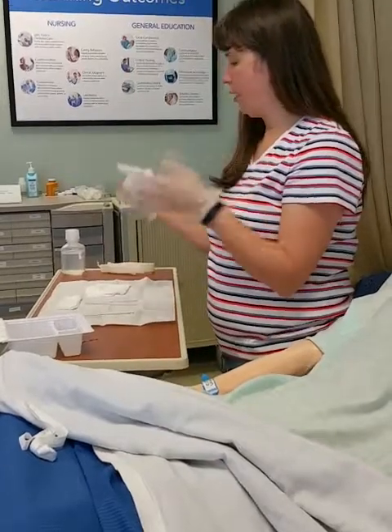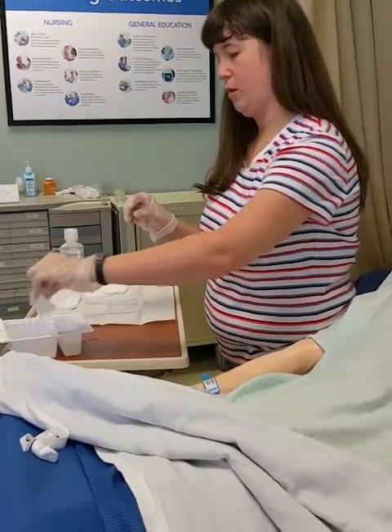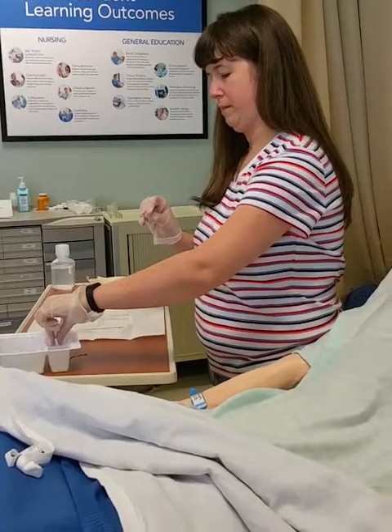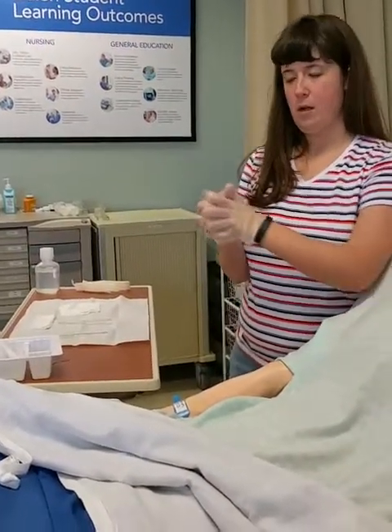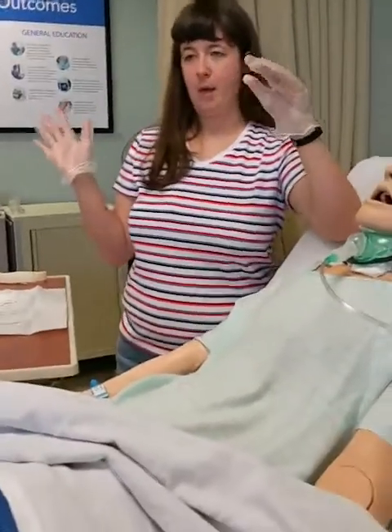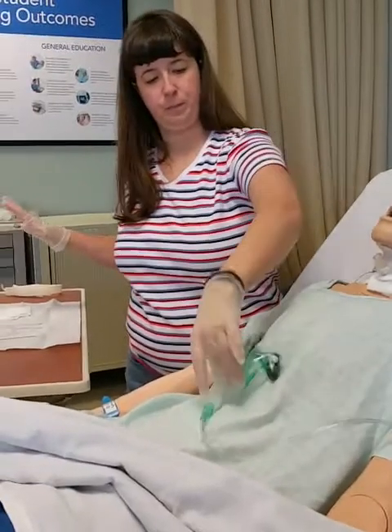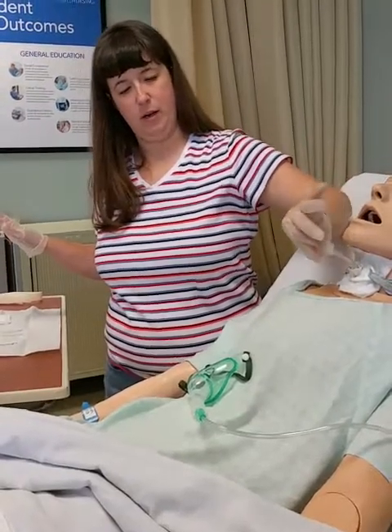And I want to do the same thing with a piece of gauze. So I'm going to dip it in the hydrogen peroxide saline, and I'm going to dip the other one in the saline. Okay. All right, now I'm ready. Pick a hand and contaminate it. Again, I'm going to keep my dominant hand sterile so I can deal with my sterile supplies, and I'm going to contaminate this hand. I'm going to take my inner cannula out, again just touching that outer portion.